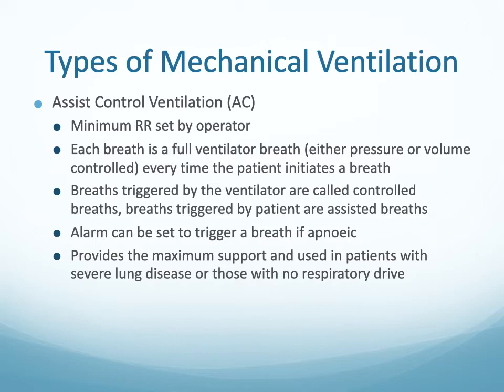That will tell you that the patient is becoming tachypneic, and in those patients you might want to switch your type of mechanical ventilation or just adjust your trigger to make sure that the patient is breathing with a normal respiratory rate.